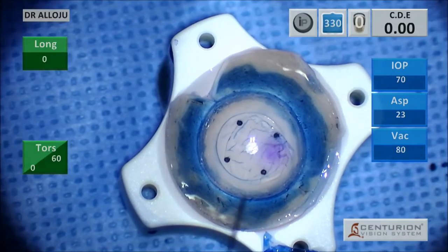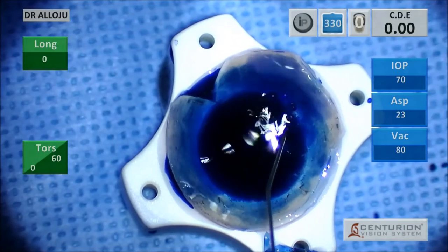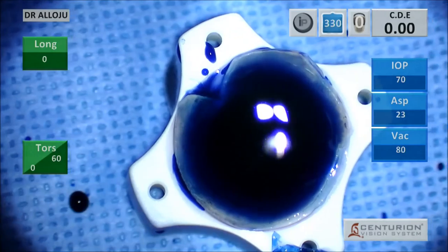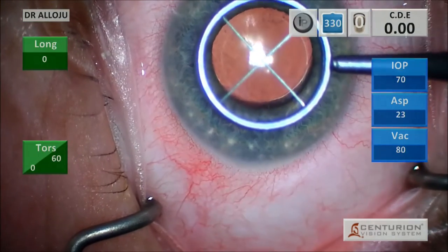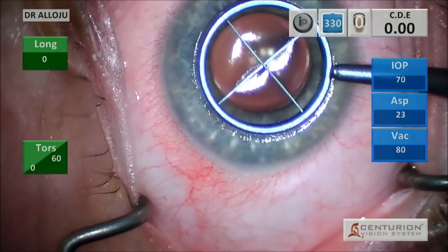Here you can see the nice S marking that was made previously that's going to greatly help us in our orientation inside the eye. We then cover the graft in trypan blue and set it aside. We then go to our patient here.